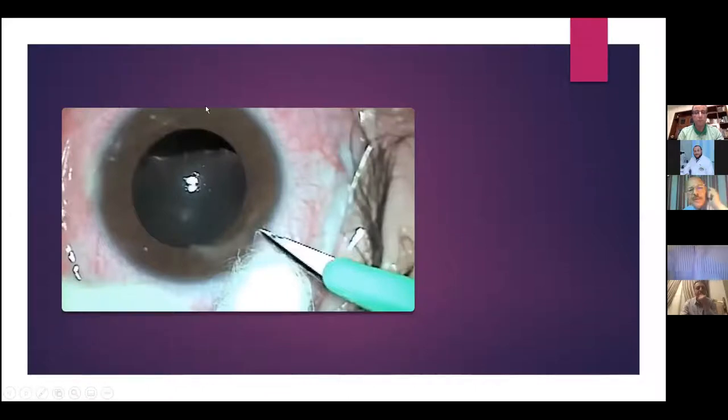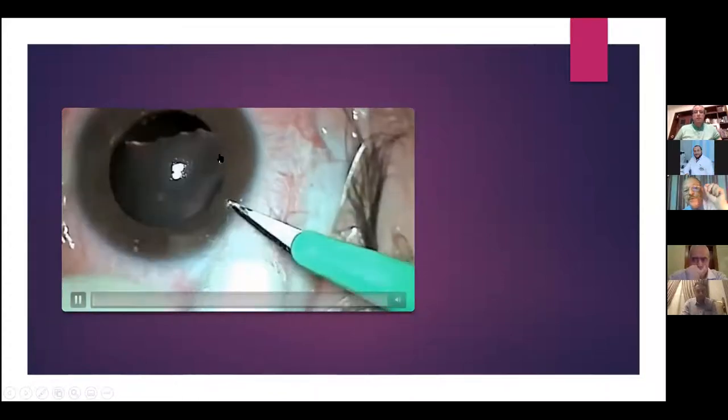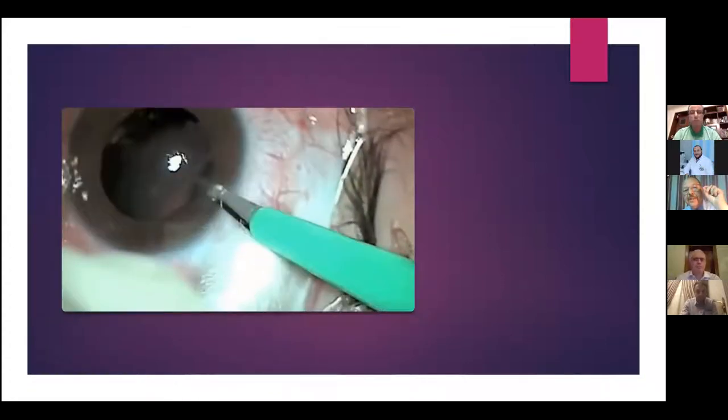This is a case of congenital Marfan syndrome, or zonular dehiscence, congenital dehiscence of the capsule. This line showing a very important sign, because, as you see, it is straight. Straight means that the zonules in this area are healthy and stretching the equator of the lens, and also on this side it is healthy and stretches the equator. So you can use this capsule and the zonules.